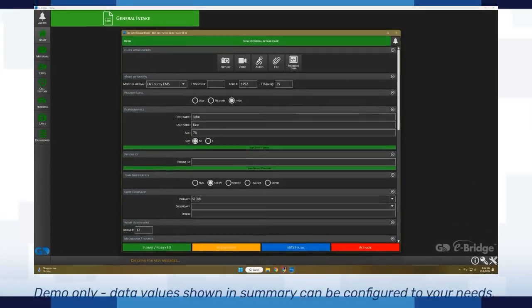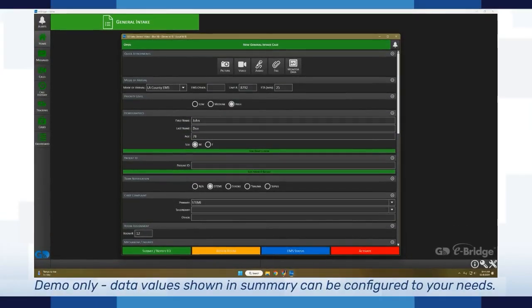Hey everybody, this is Mitch with General Devices. Today I want to go over and highlight our newest feature on eBridge, and that is our case summary feature.